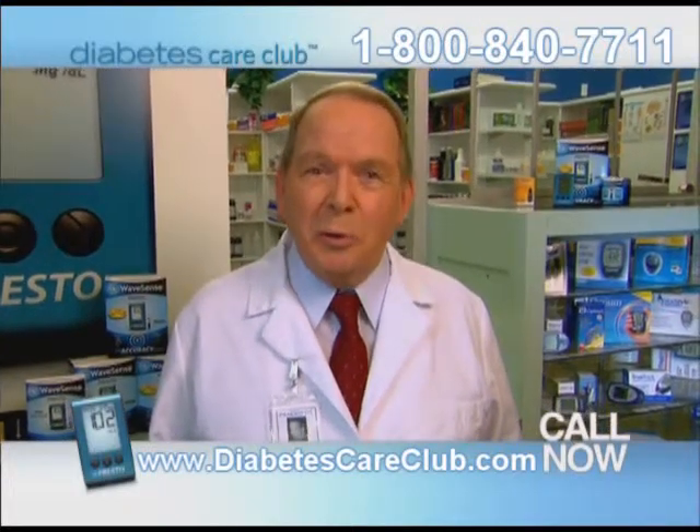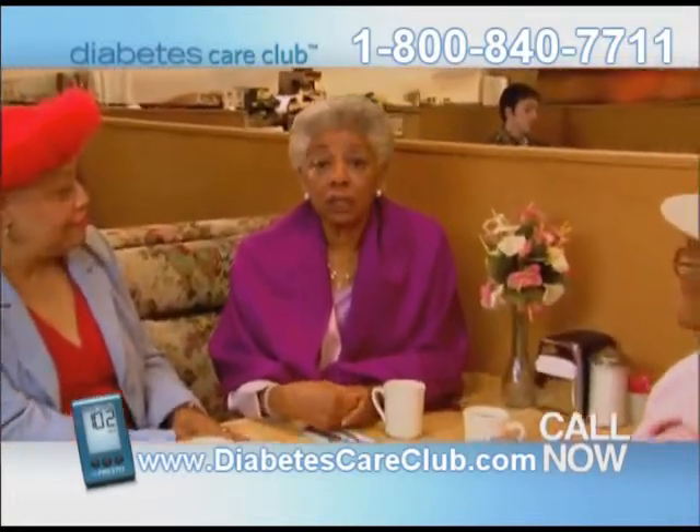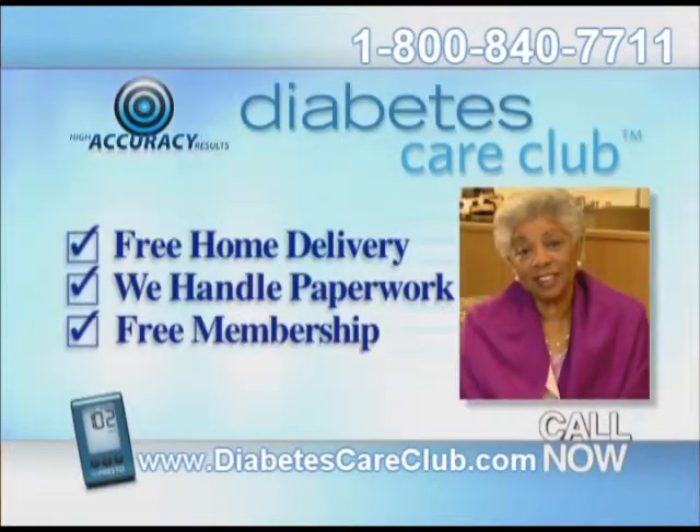Call and find out why over 100,000 patients choose Diabetes Care Club. You don't have to code anymore. Upgrade your meter and change the way you test now. Call 800-840-7711.